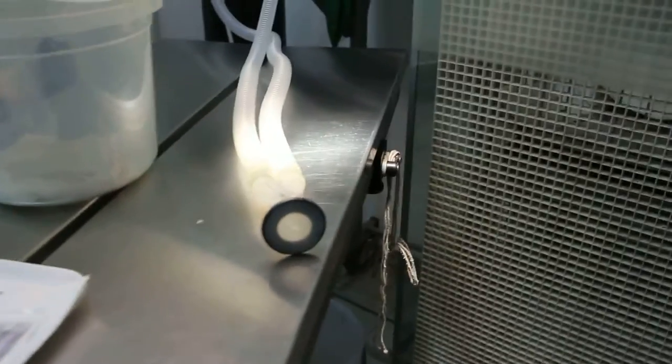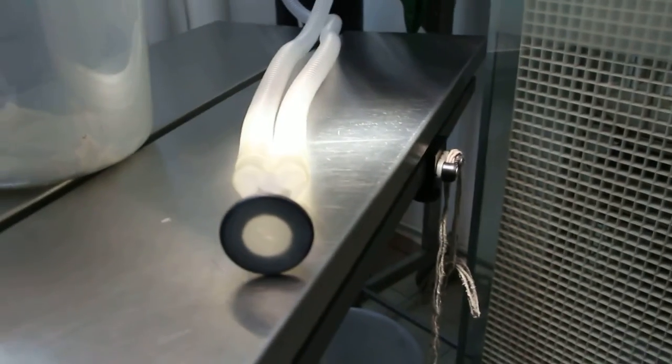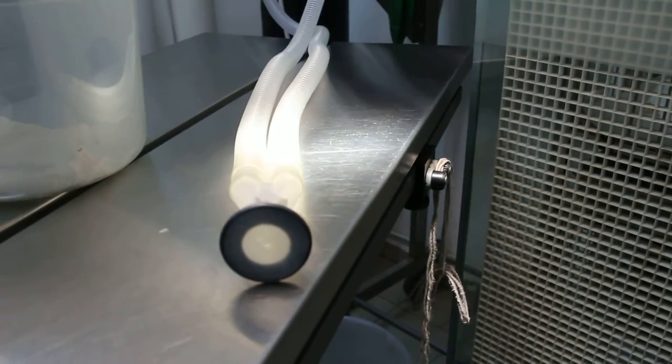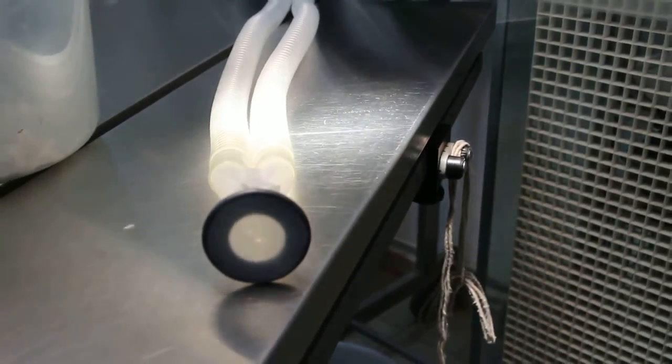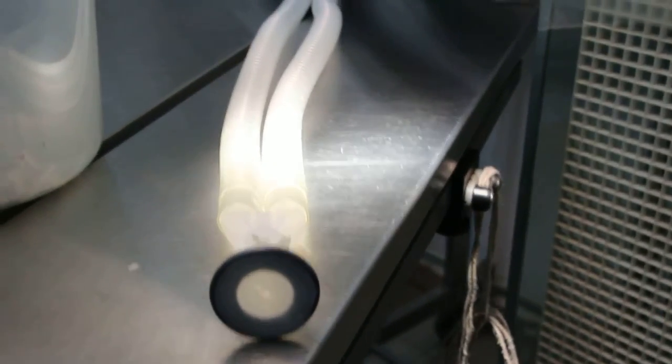Through the mask here. There's a small hole where you can breathe. This is modified for hamsters.